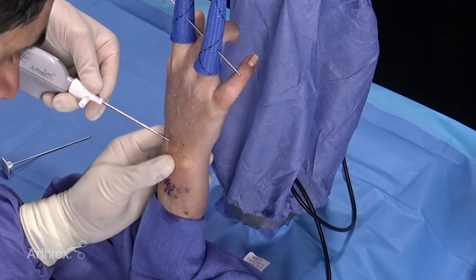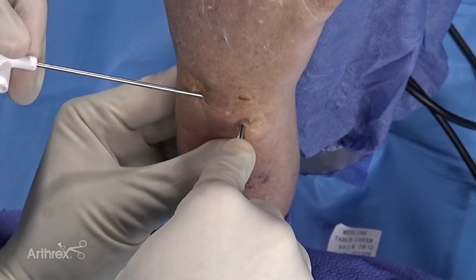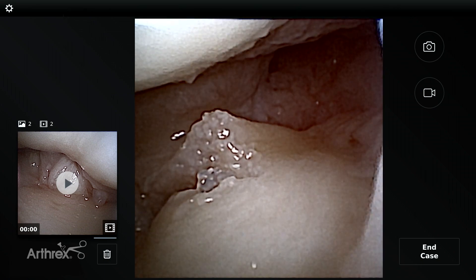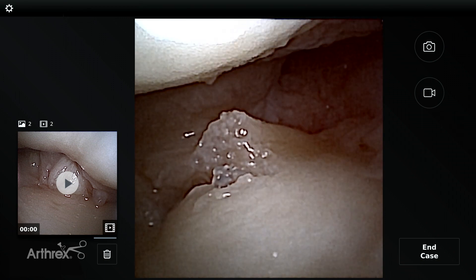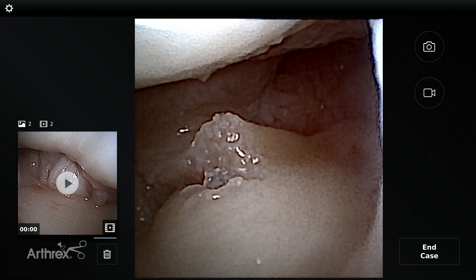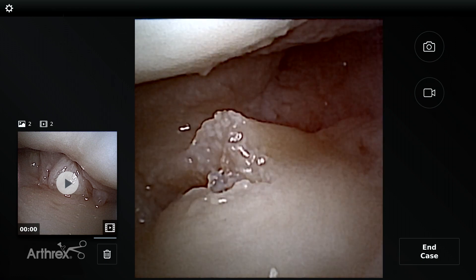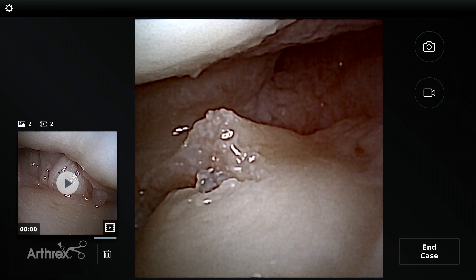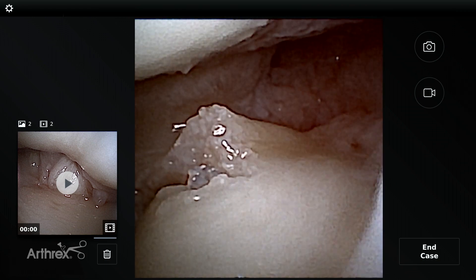What I've done now is I've removed the needle, made an incision where the DRUJ portal is going to be, and I've taken some tenotomy scissors or a snap or a curved mosquito. I've come over the ulnar head — remember we want to avoid any iatrogenic injury to the cartilage. Now with the nanoscope still in the radiocarpal joint, I'm underneath the TFCC, so with confidence you can deduce that you're in the correct position. There's nothing more frustrating than going in blind, but under the nanoscope you can see exactly where you want to be.